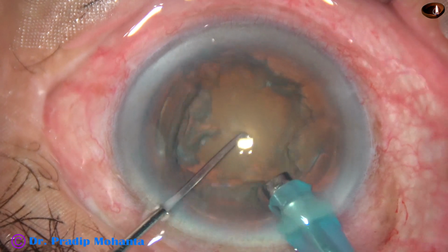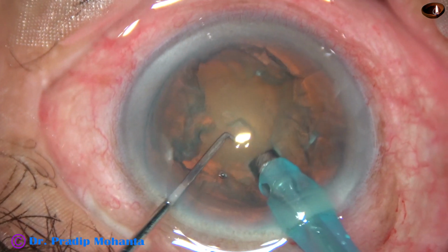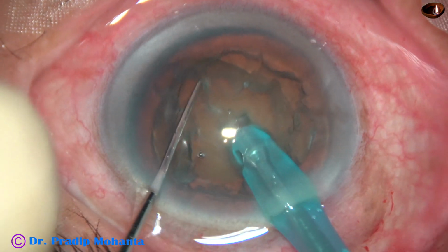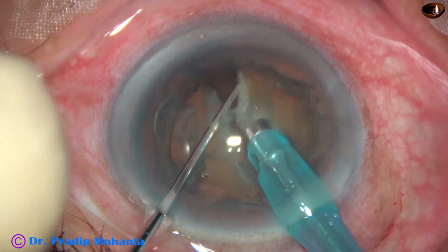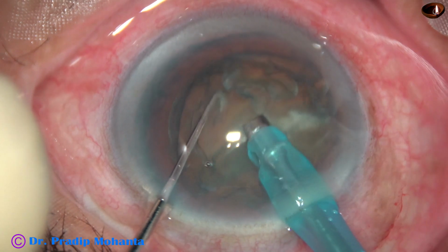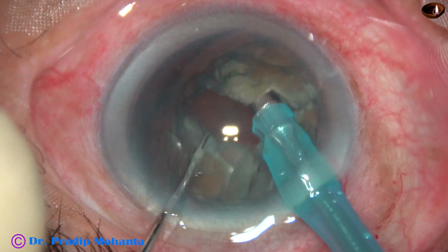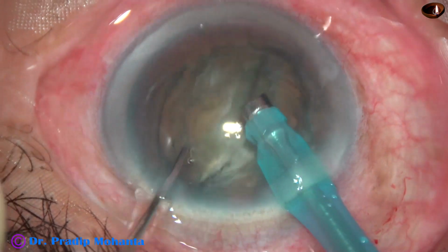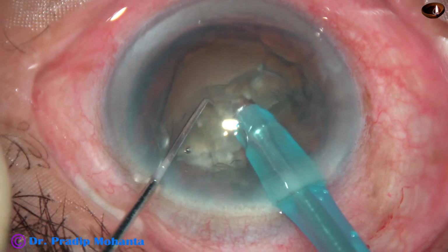And now see how easily you can chop this lens mass with this. Go, hold the nucleus and chop it. Go, hold the nucleus and chop. Rotate and chop the other heminucleus.